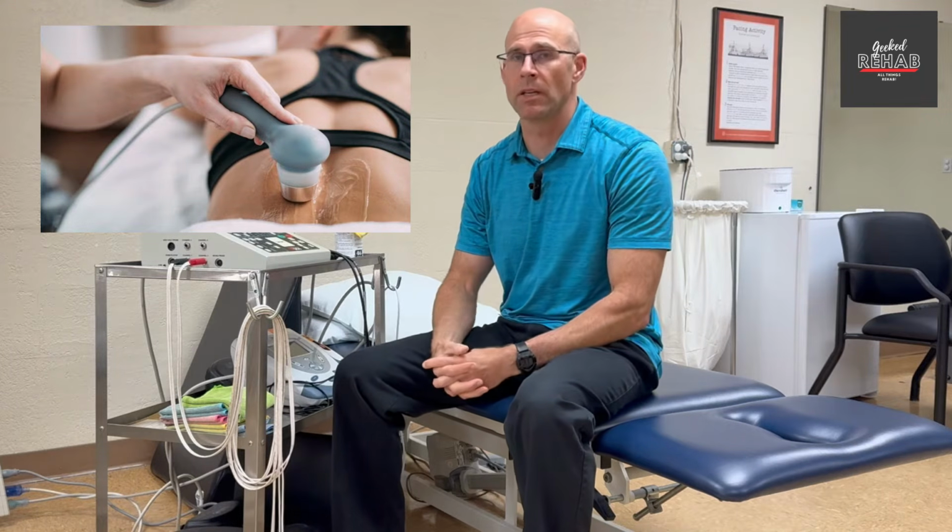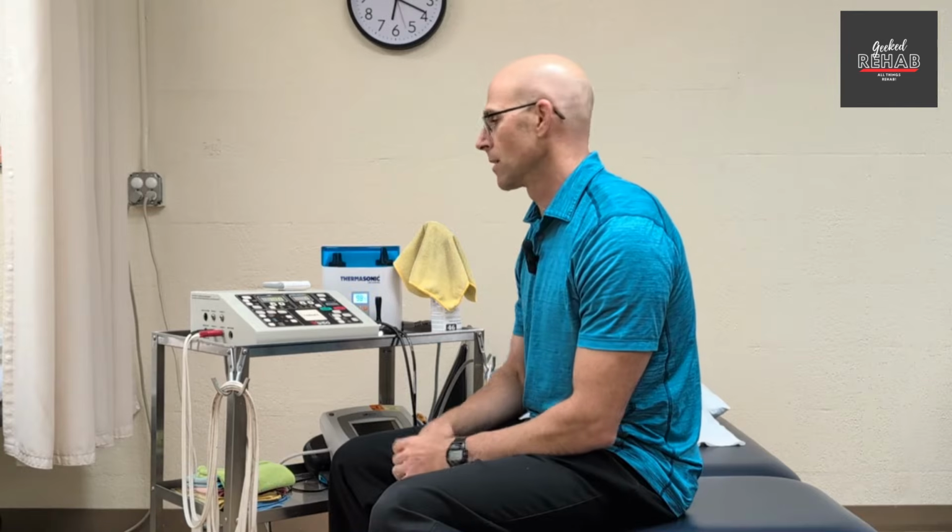I want to talk to you about one of the modalities that's pretty popular in therapy, or it has been for quite many decades. It's got its place in usage. It's called the ultrasound machine. And it's not the same ultrasound you get when you're pregnant and you're trying to see that little peanut in there. It is an ultrasound that is absorbed by the tissues.